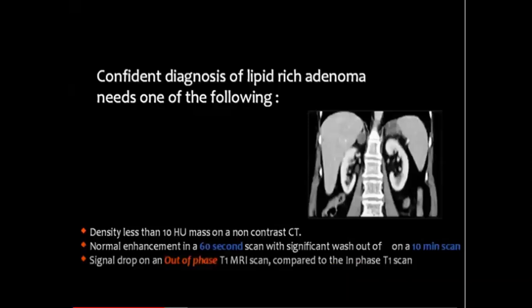So a confident diagnosis of lipid-rich adenoma needs one of the following: either density less than 10 Hounsfield units on non-contrast CT, or normal enhancement on the 60-second scan with significant washout on the 10-minute scan, or signal drop on out-of-phase T1 MRI compared to the in-phase T1 scan.